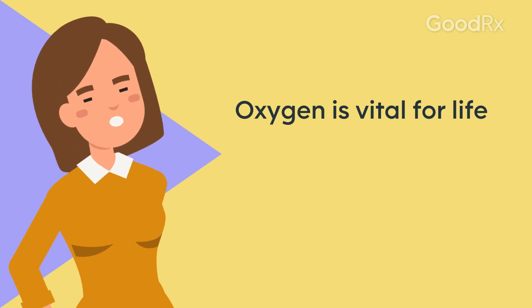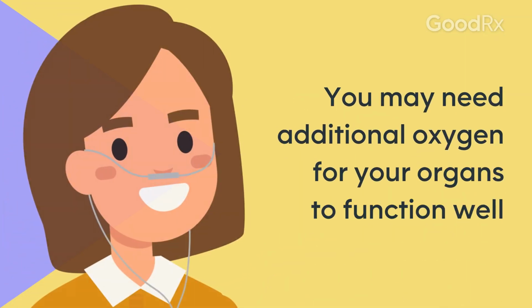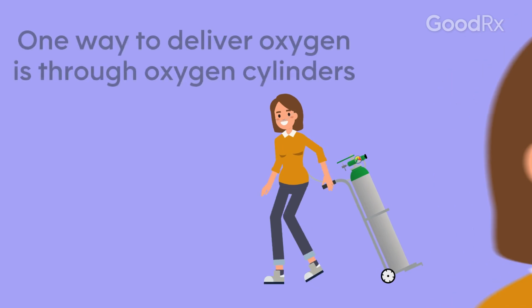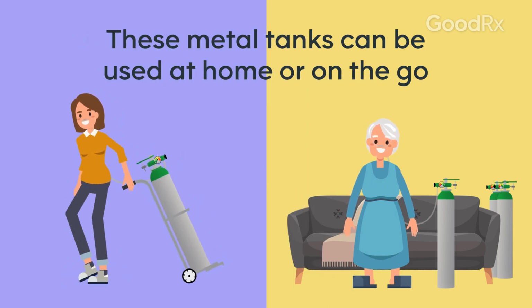Oxygen is vital for life. If you have a chronic lung disease, you may need additional oxygen for your organs to function well. One way to deliver oxygen is through oxygen cylinders. These metal tanks can be used at home or on the go.